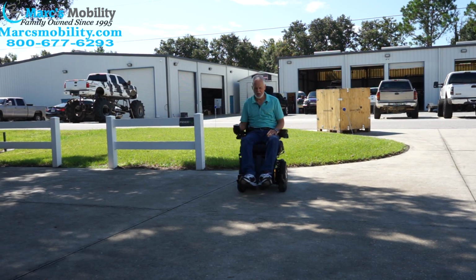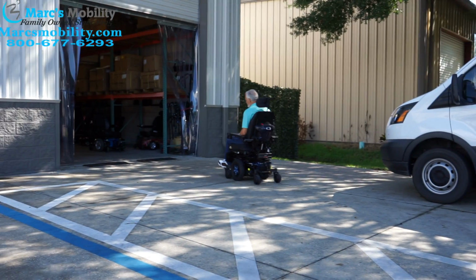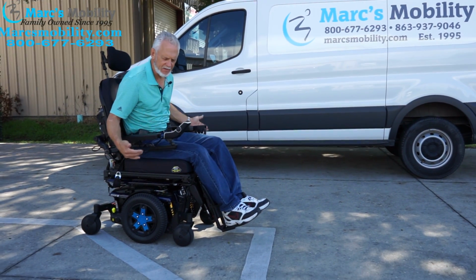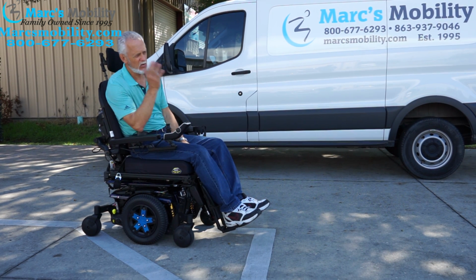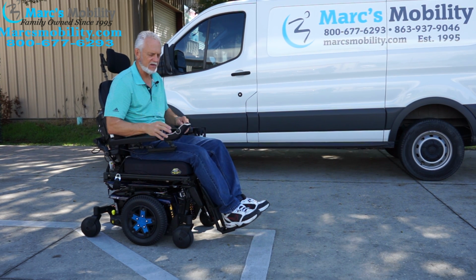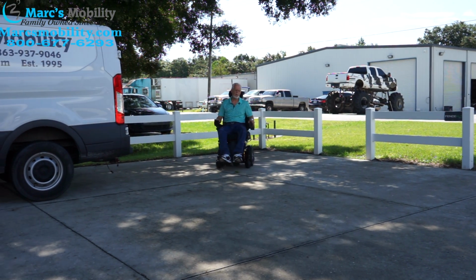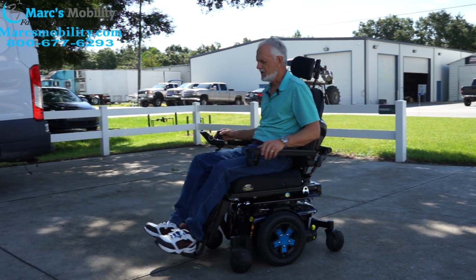So this is one of my favorite chairs, the Quantums. When you let go, it automatically brakes. It's got brakes in the motor, so when you let go, it'll stop within a few feet. Top speed I got going over here on this flat surface is about 6.2 miles an hour, so it's a pretty fast chair, 6.2 miles an hour. This one's very easy to drive. Anybody can drive this chair. It responds real slowly. It doesn't do anything quick.